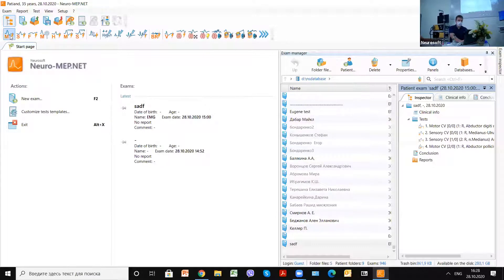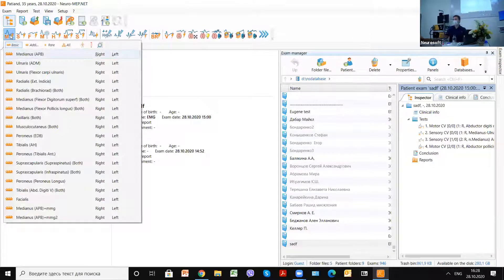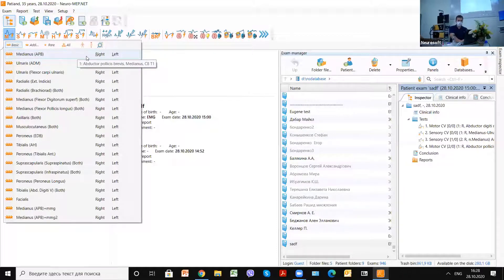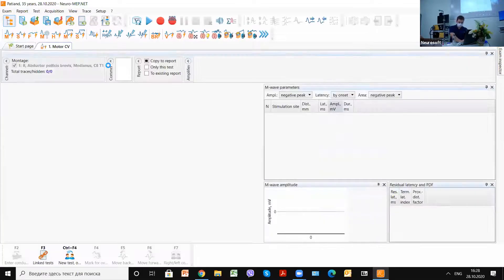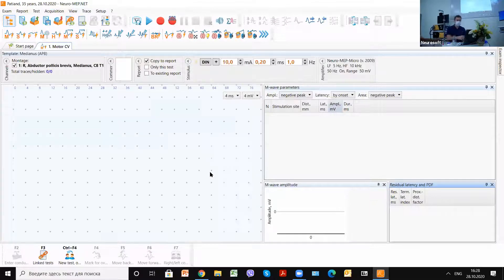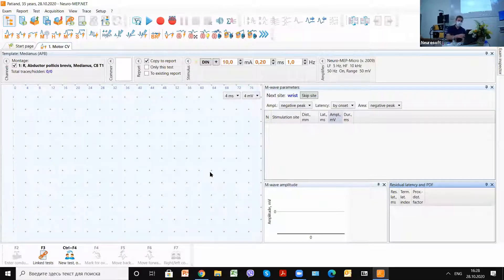Here we choose motor conduction velocity. Today we will do median nerve conduction velocity, and we choose right hand. From that moment we can see the main window of our EMG examination.